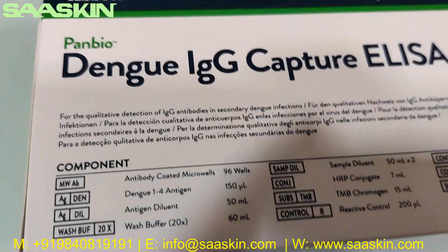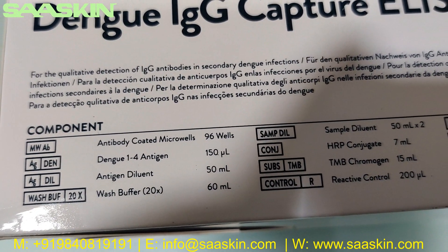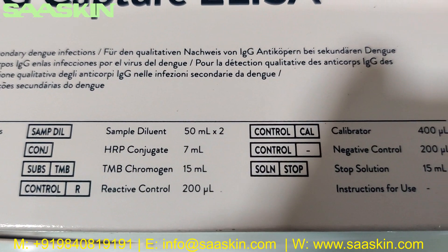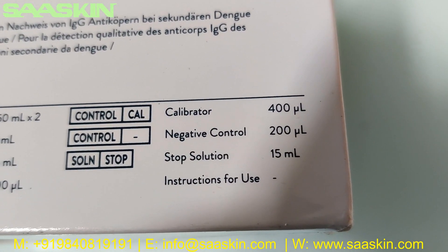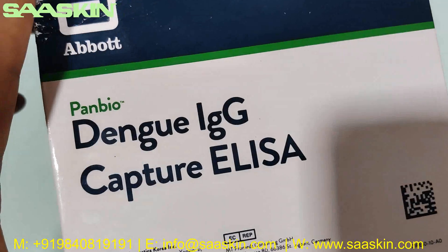If you look at the contents, let me quickly go through the contents in the box. You can see there is an antibody-coated microplate with 96 wells, and Dengue 1-4 antigen and antigen diluent, wash buffer, sample diluent buffer, HRP conjugate and TMB chromogen, reactive control, calibrator, negative control, stop solution, and instructions for use. So this is what the contents are.